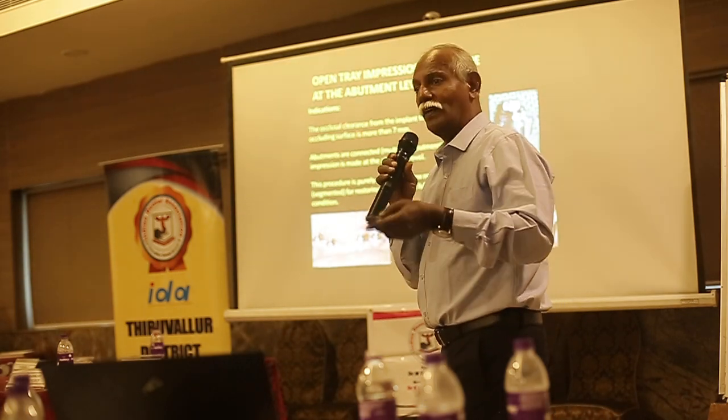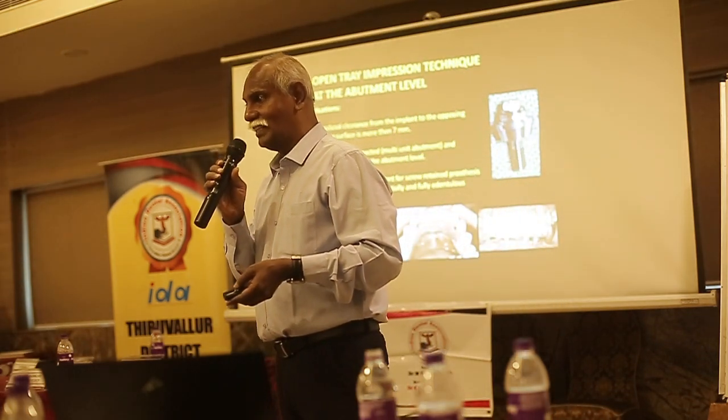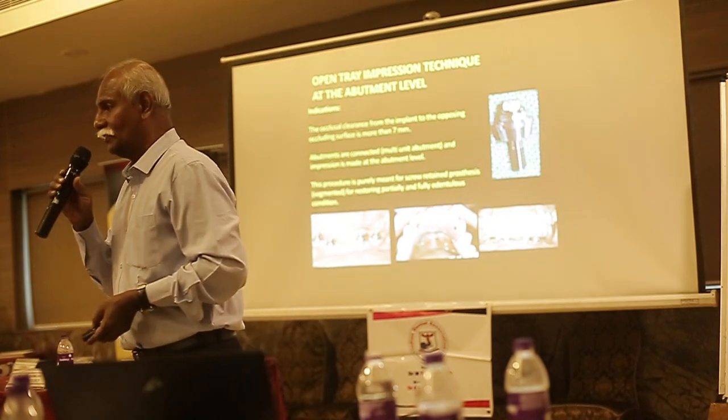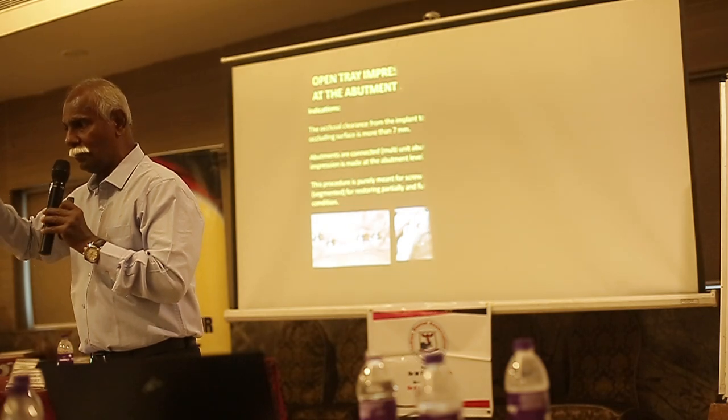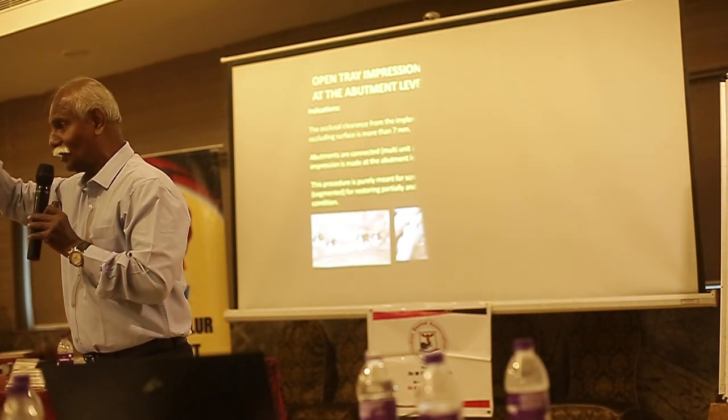Now, open tray technique with a multi-unit abutment. Here the patient had a good amount of inter-arch space with a good amount of soft tissue thickness. I cannot place an implant maybe 10 millimeter, and my crown would be about 11 millimeter. That is not a good case again.